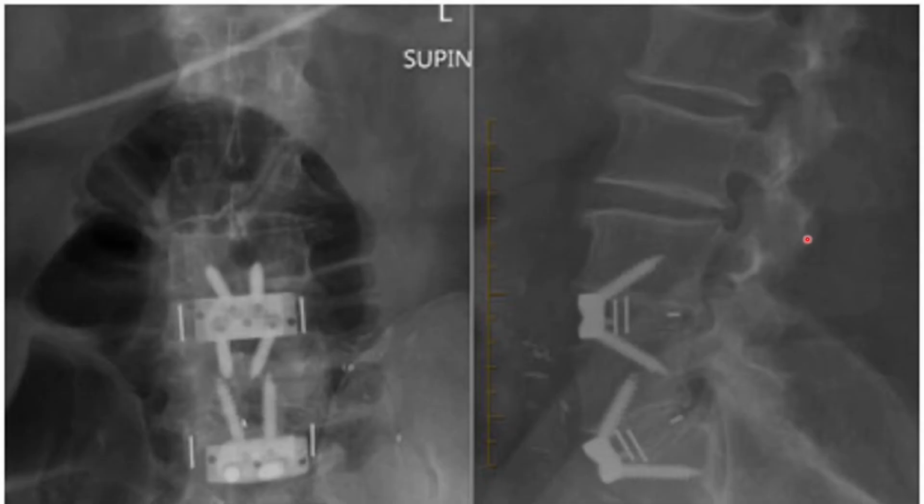Here's an example of two-level ALIF performed at lumbar 4, lumbar 5 and lumbar 5 sacrum 1 using standalone cages and screws. You can see how a big cage can be inserted right from the front with screws going into the vertebra above and below.